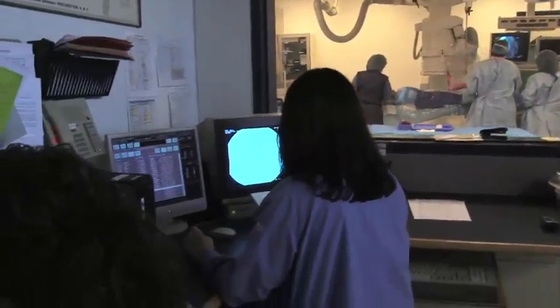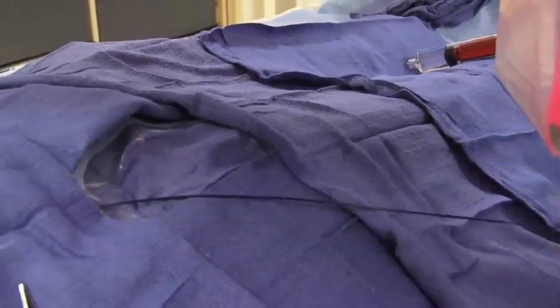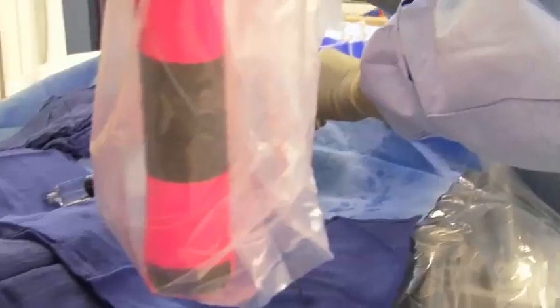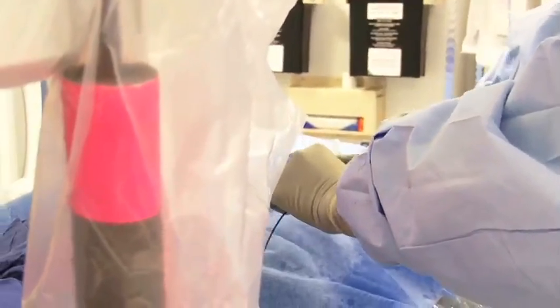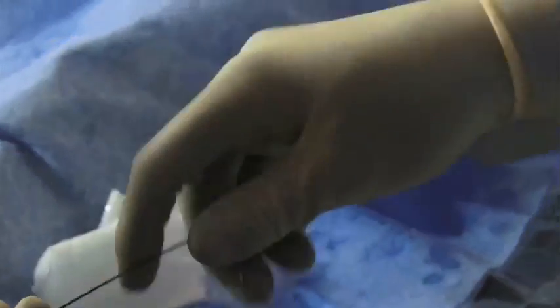The fascinating thing about it is we use some of the advanced imaging modalities, be it CAT scan or real-time X-ray or ultrasound or some combination of these different modalities. So we use state-of-the-art fluoroscopy equipment, which is angiographic equipment that helps us guide catheters and wires to various spots throughout the body, and we typically guide these catheters and wires through different blood vessels depending on the condition.